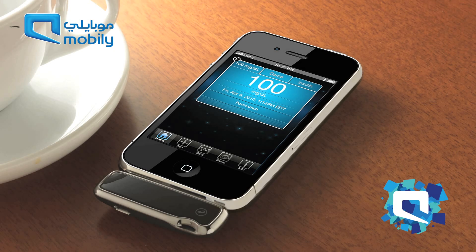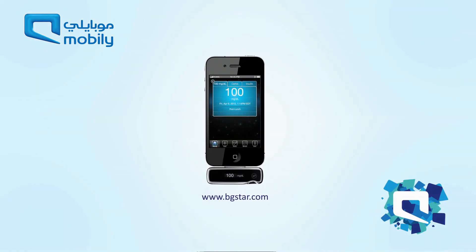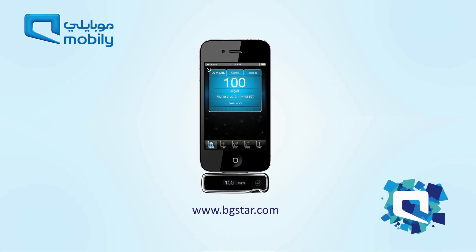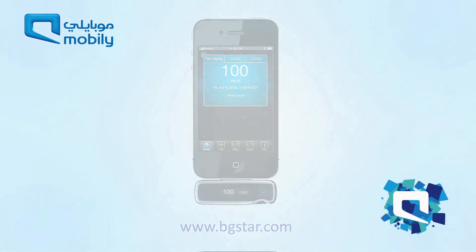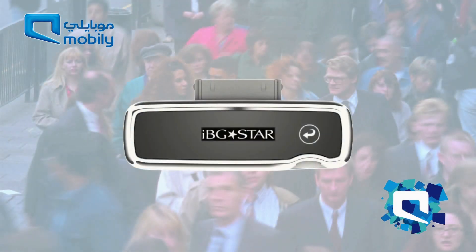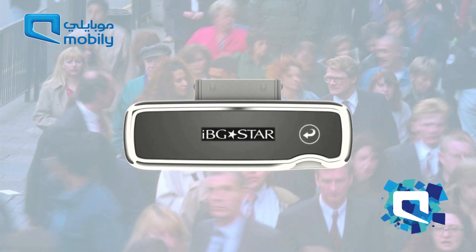Equally, IBGSTAR can be left attached to an iPhone or iPod Touch, so it's one less device to carry around. With a telephone hotline and apps, the IBGSTAR allows access to a whole new world of diabetes management tools. So with IBGSTAR, people with diabetes can seamlessly integrate diabetes management into the rhythm of their lives.